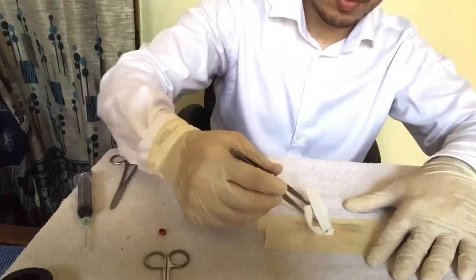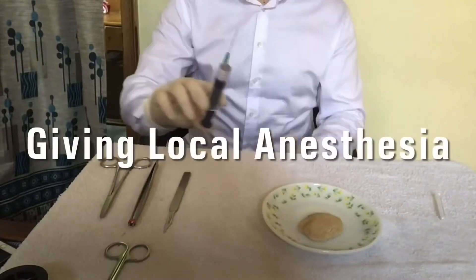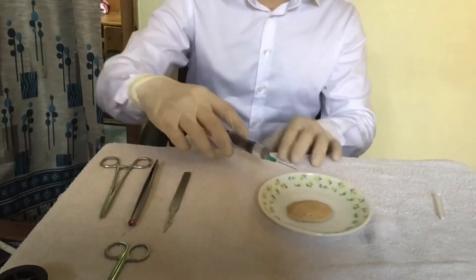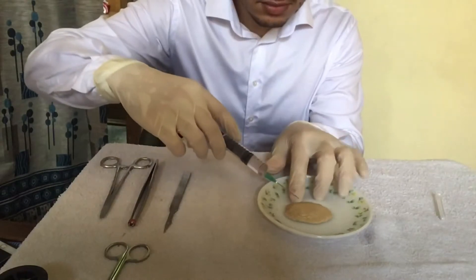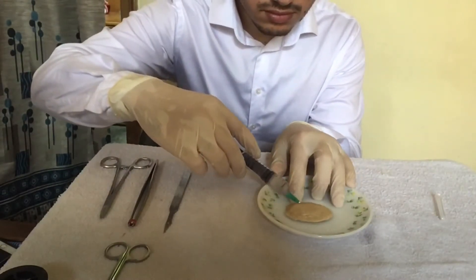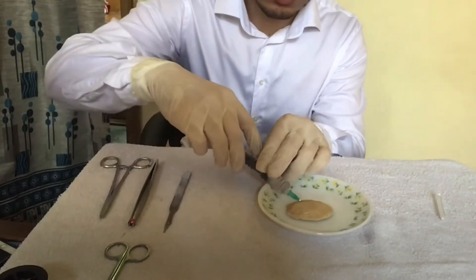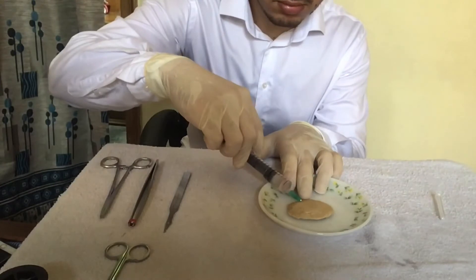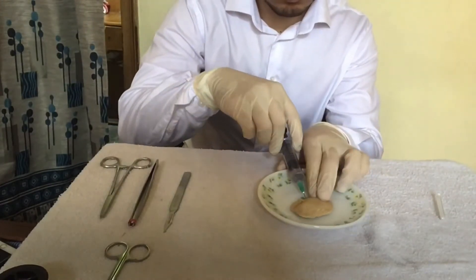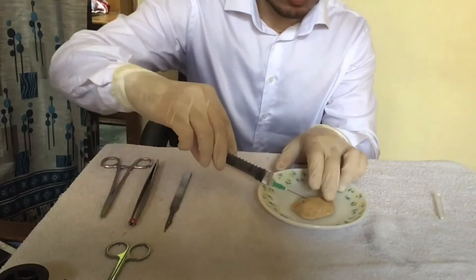Leave the wick halfway outside as shown. For local anesthesia, take 5ml lignocaine in a syringe and insert the needle just under the skin, distal to the site of injury. After completely inserting the needle, aspirate a little bit first to rule out the possibility of insertion into a blood vessel, then keep injecting in all directions from the same site of injection.